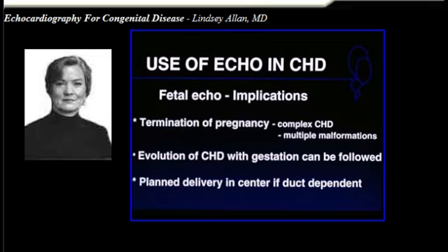Now, what are the implications of fetal echocardiography? Is this going to impact at all on your practice as a cardiac surgeon? Well, it may do, particularly in the future, as increasingly we're making diagnosis of congenital heart disease early in pregnancy, because some parents will elect termination of pregnancy for very complex forms of congenital heart disease or for forms of congenital heart disease that are associated with other malformations. So that may indeed impact on our practice as the years go on, and I think as we look into the next century, this will have an increasing implication on our pediatric practice.